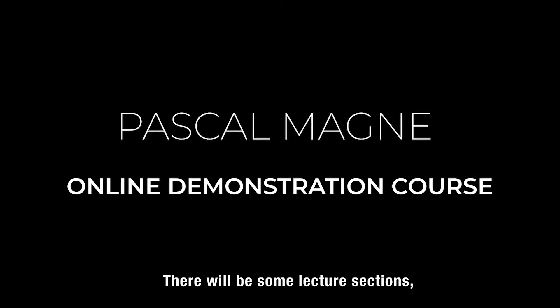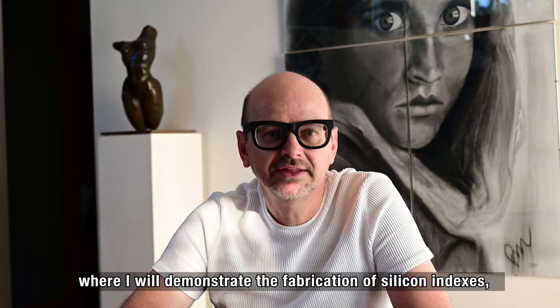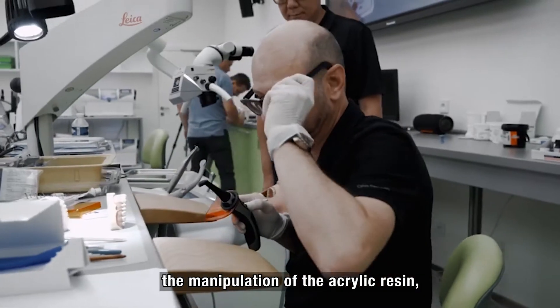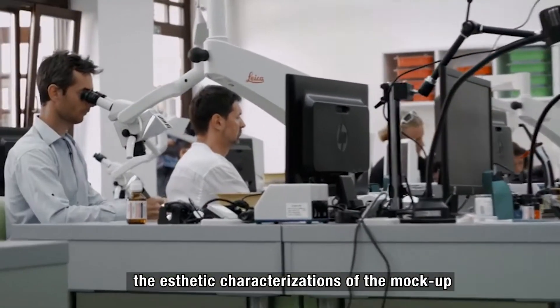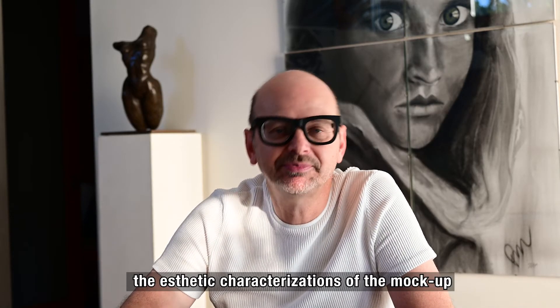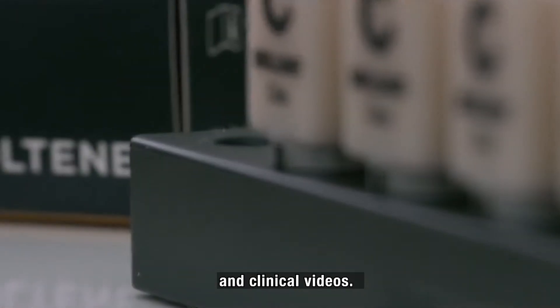There will be lecture sections, but mainly there will be large video segments where I will demonstrate the fabrication of silicone indexes, the manipulation of the acrylic resin, the placement in the mouth, the trimming, and the aesthetic characterizations of the mock-up using a typodont model. There will of course also be clinical examples and clinical videos.